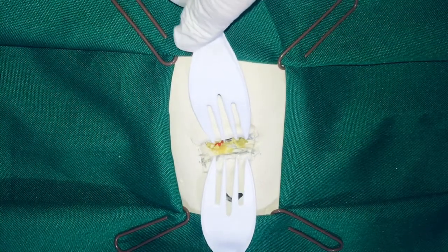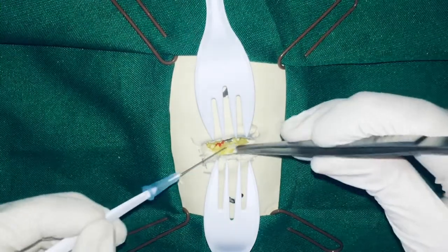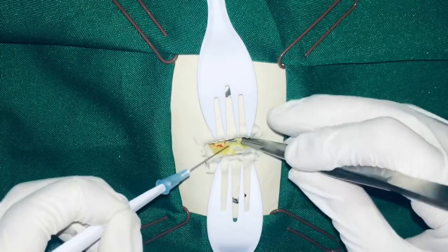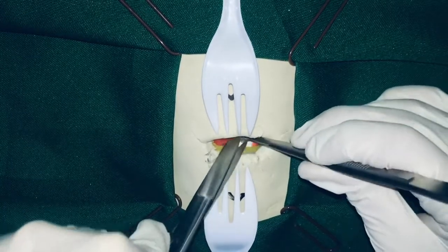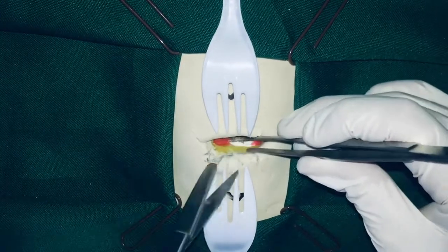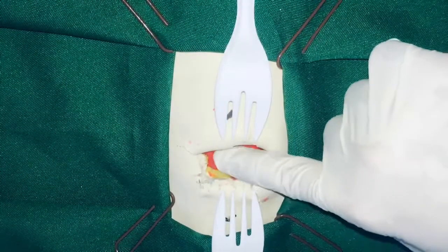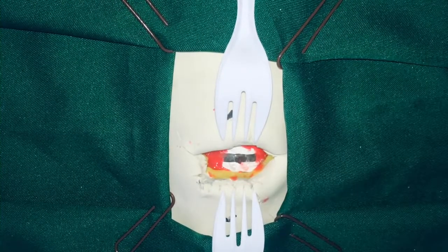Retract the tissues with Senn retractors. The subcutaneous tissue can also be dissected using the cautery. Divide the fascia with scissors, remaining strictly on the midline in a vertical plane to avoid injury to the inferior thyroid veins. Intermittent palpation of the airway can be done to check if it's deviated from the midline.